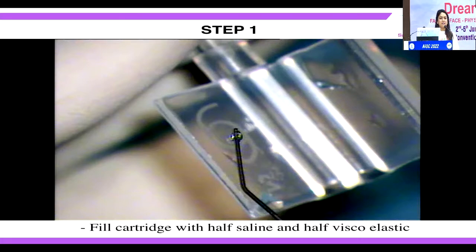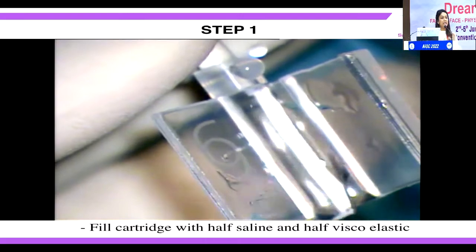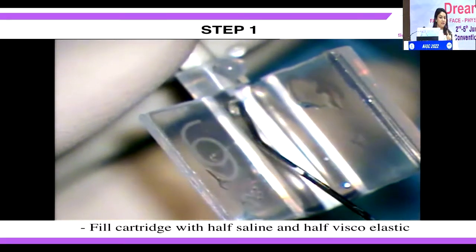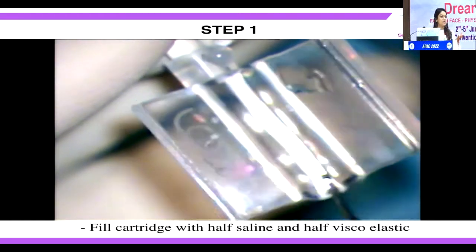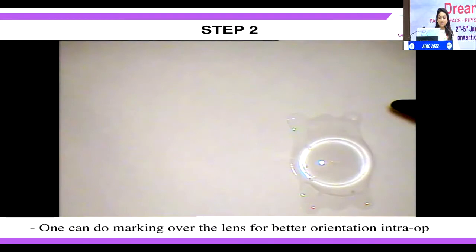Loading of an IPCL is fairly simple. It's just like any plate haptic PCIOL. A very important thing is, don't completely fill the cartridge with visco. Fill it partly with visco and partly with saline, because if the cartridge is filled with an excess amount of visco, it can lead to a flip.